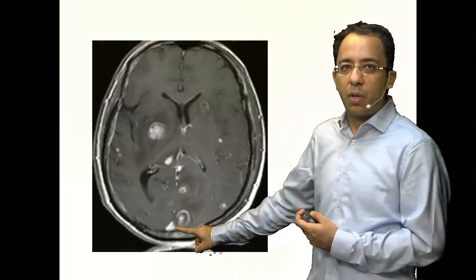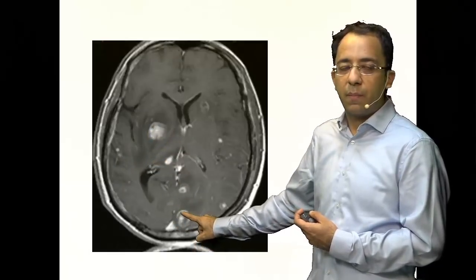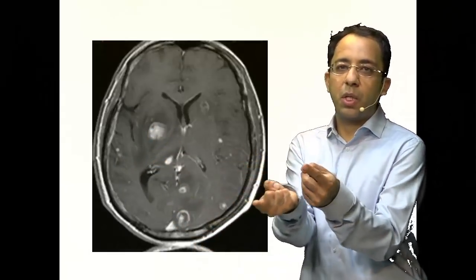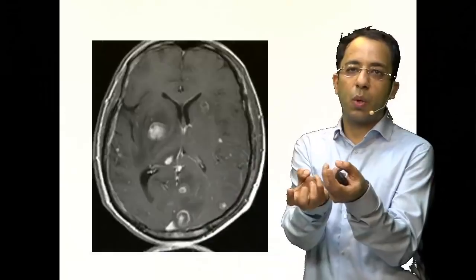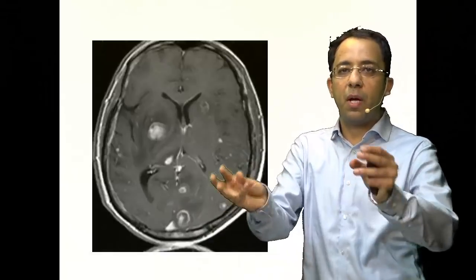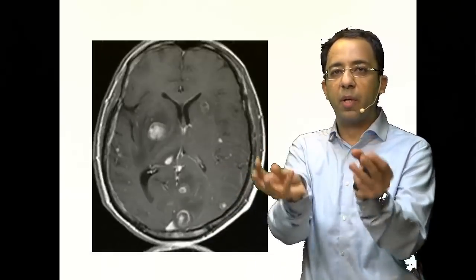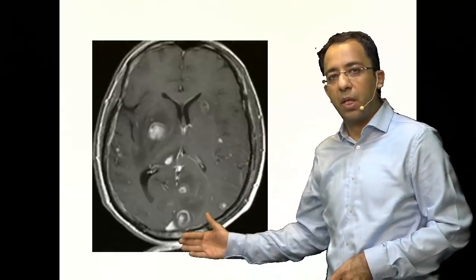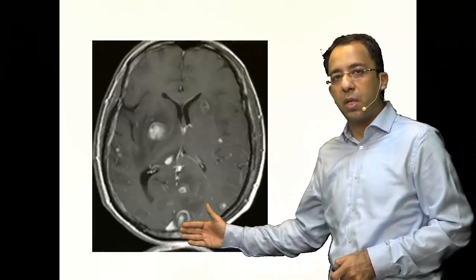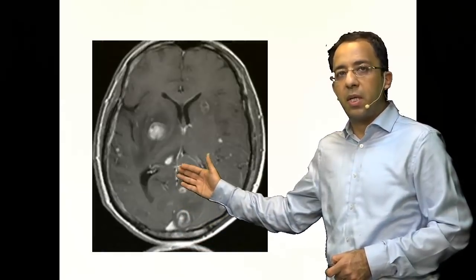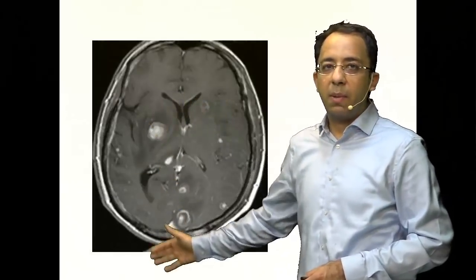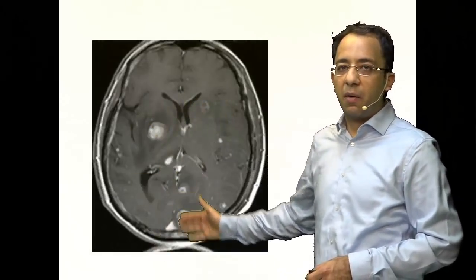On the T1 post-gadolinium image you can see the lesions showing ring enhancement. That ring of enhancement depicts the zone of hyperemia and the inflammatory area where blood-brain barrier disruption has occurred — confirming multifocal ring-enhancing lesions in the basal ganglia and gray-white matter junction.